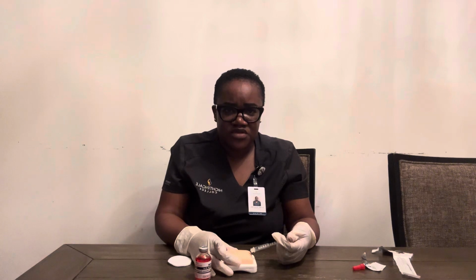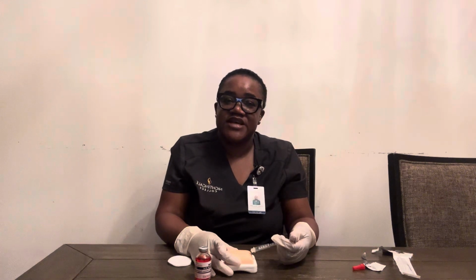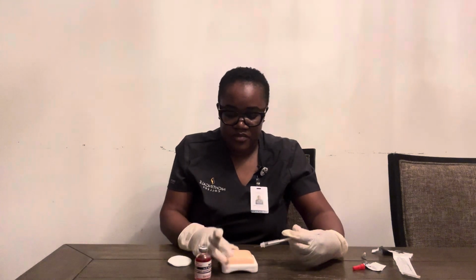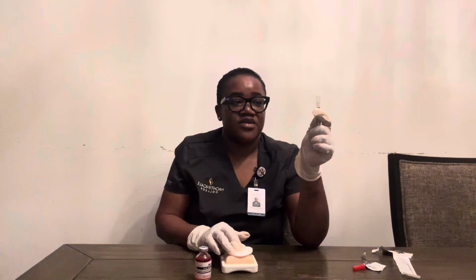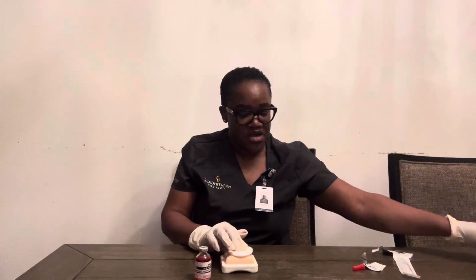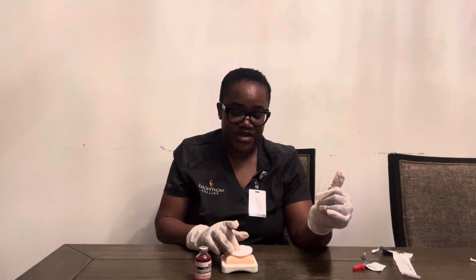I should also notice a little bleb about 6 to 10 millimeters as I inject, and I'm gonna place my gauze, and then if the needle has a safety mechanism, I'm gonna engage that, and then I'm gonna discard it in the sharps container. I could also apply a bandage if necessary.